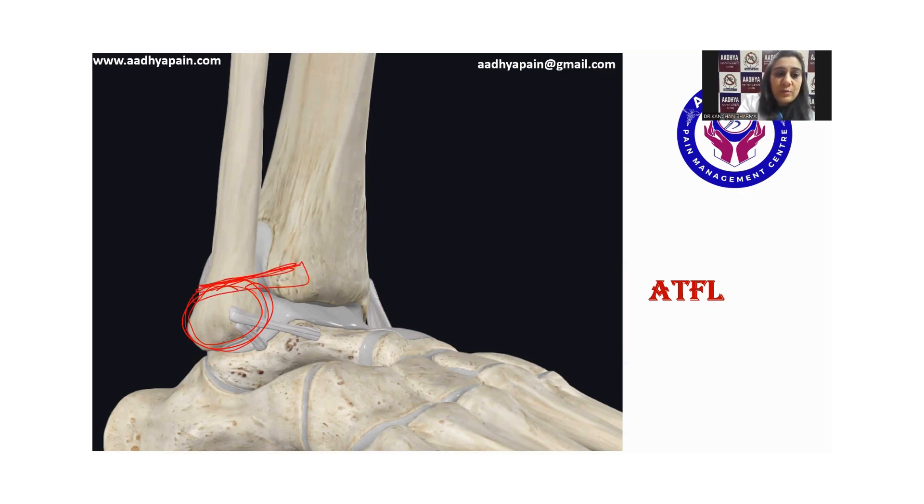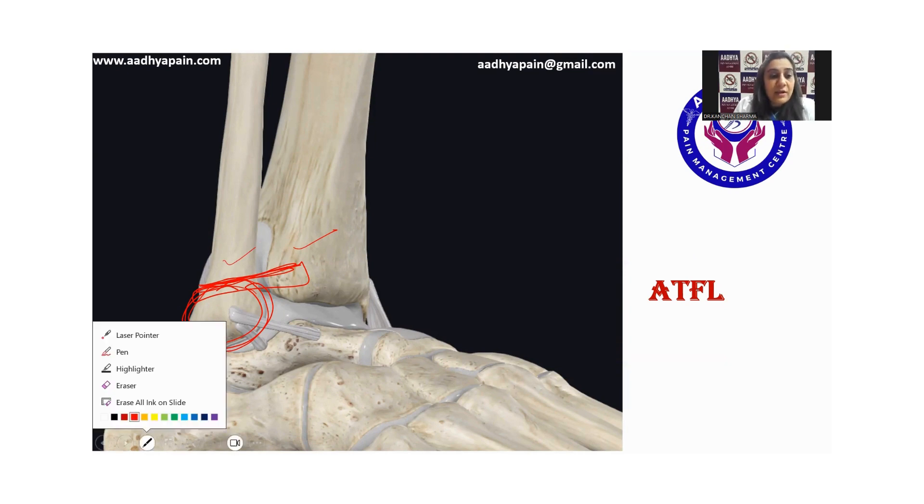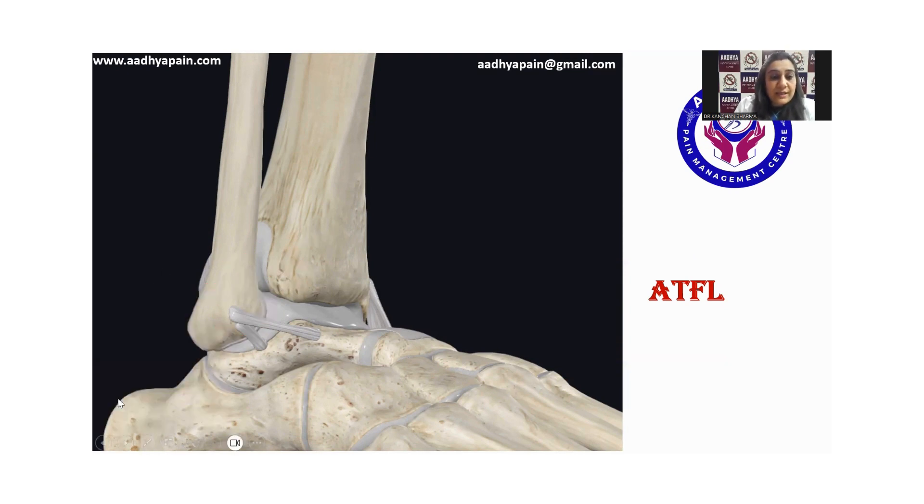So once we are keeping our probe in short axis over the lateral malleolus, we will be able to see the tibia and the fibula in short axis. Once we have identified that, what we are going to do is slide down. The moment we slide down, the tibia will disappear from our view and the talus will come.